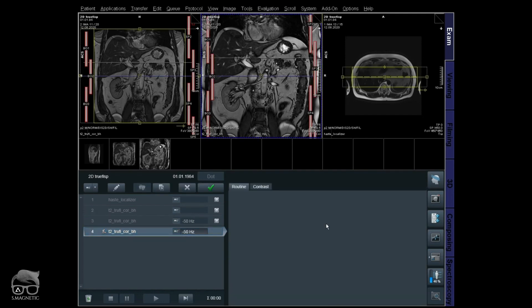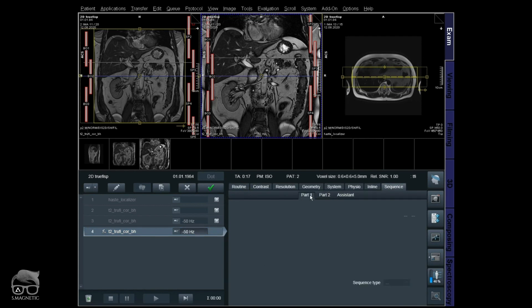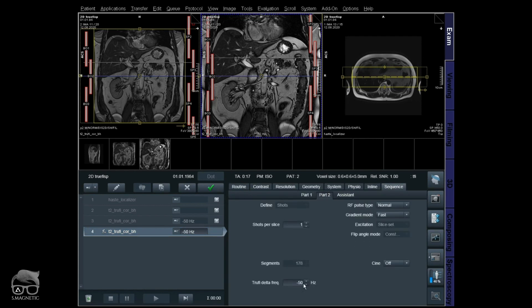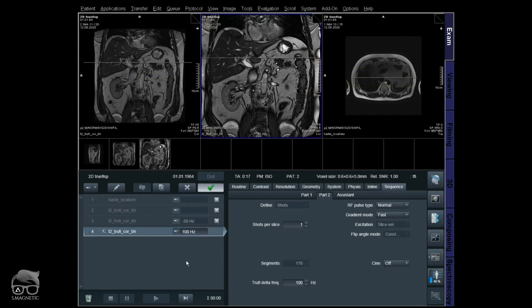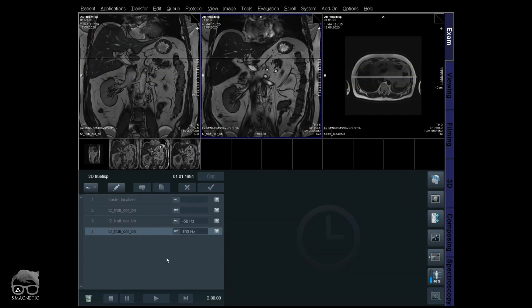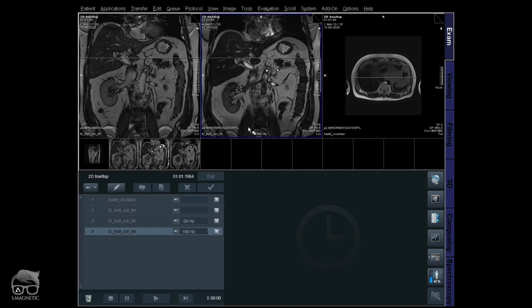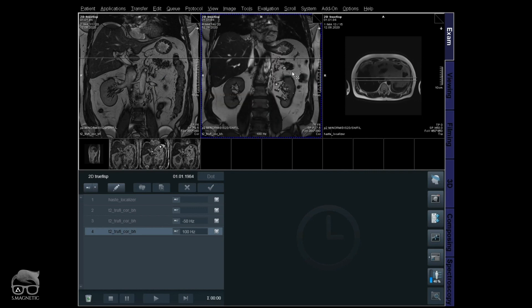Let's do another one here now — we're going to try 100 Hz. That's the new one. It seems like the artifact has shifted away, but let's go into the viewer and compare.